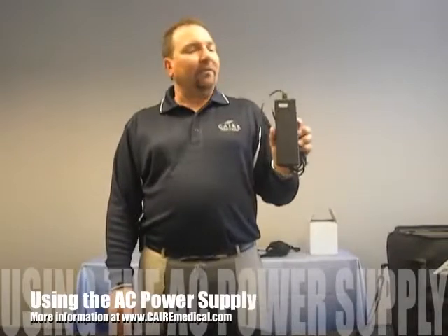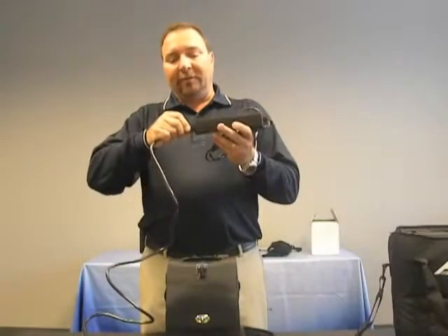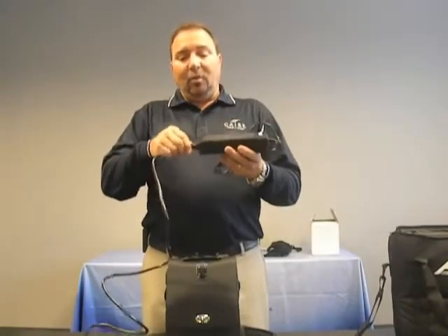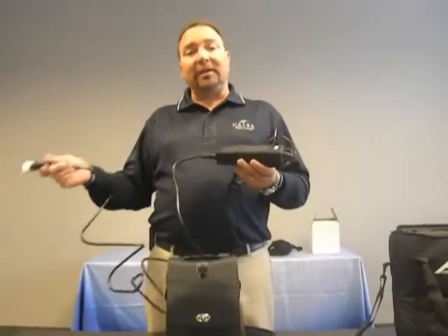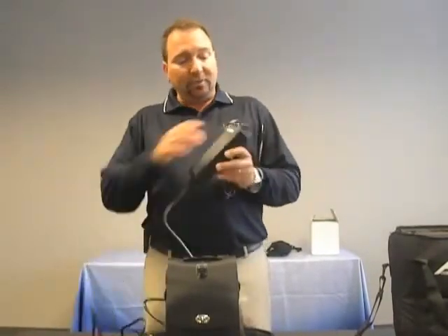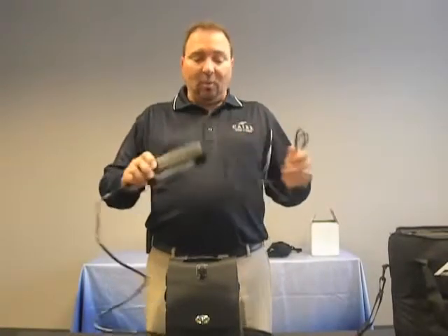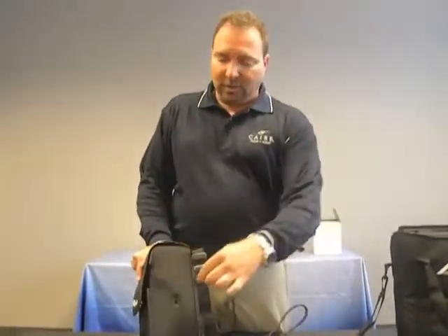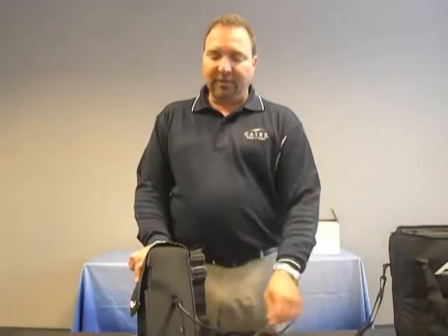Using the power supply for the FreeStyle 5 is as simple as connecting your power cord to the end of the power supply, making a tight connection. Once you have the power cord connected to the power supply, you can now plug the power cord directly into the wall outlet or electrical outlet of your home. In doing so, you should see a green light illuminate on the power supply, letting you know that you have a secure connection. Once power is available to the power supply, you can then plug the cord of the power supply directly into the side of the FreeStyle 5 by pushing it into place, and it is now ready to be used on AC current.